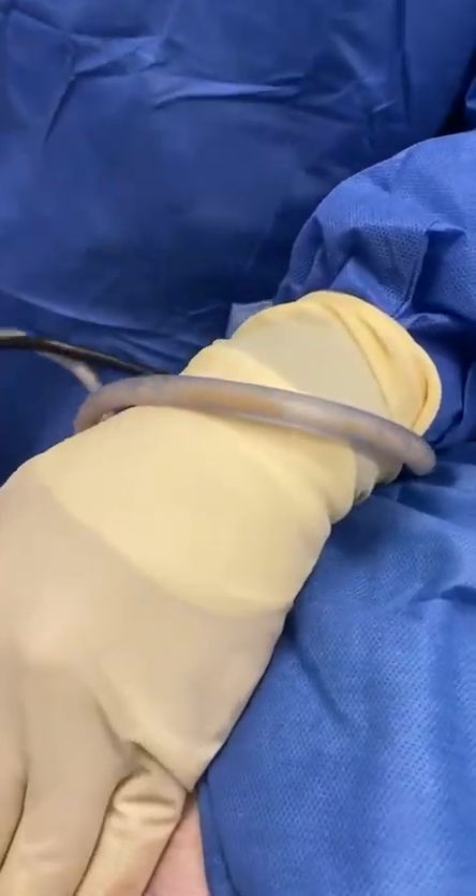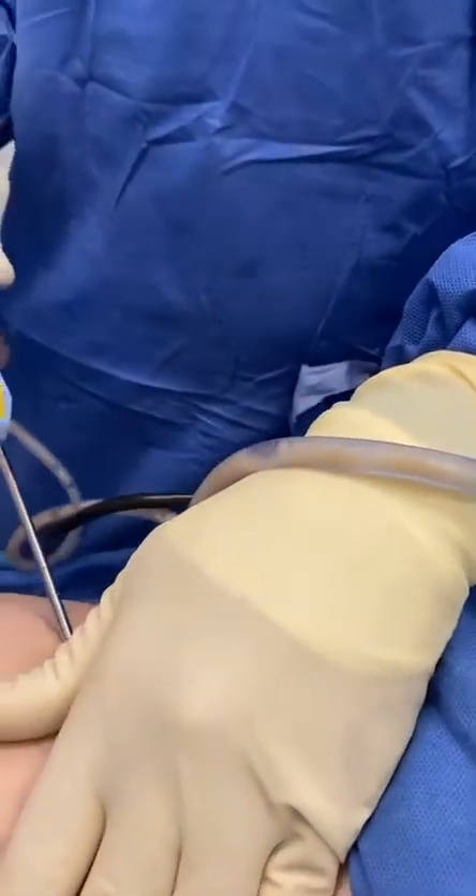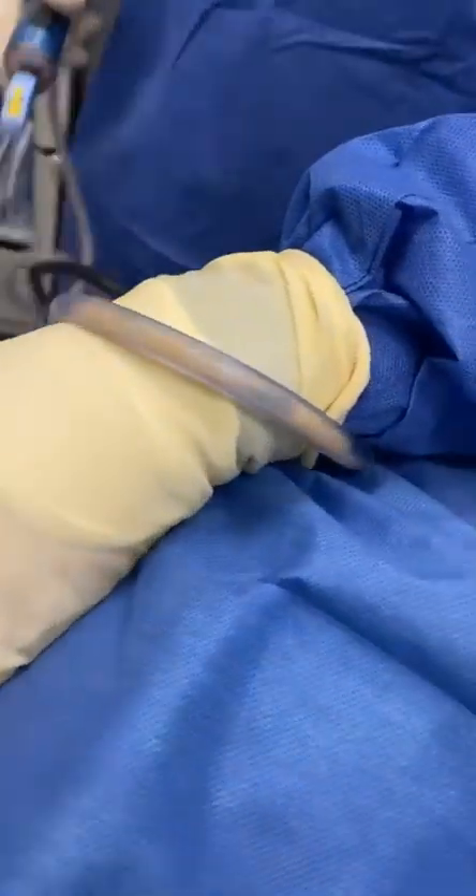More of that yellow beautiful fat — it's gorgeous. We're not even going to do a fat transfer, but we just don't like bleeding. If we were going to do a fat transfer to the buttocks, all this yellow fat would be going in there without blood.